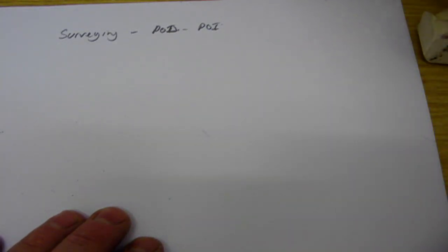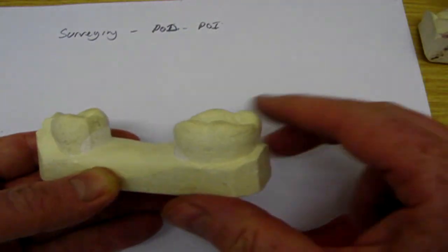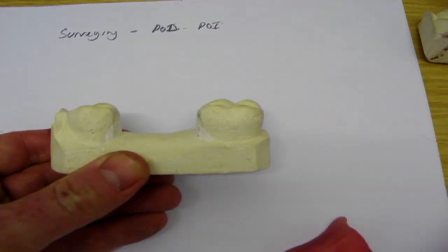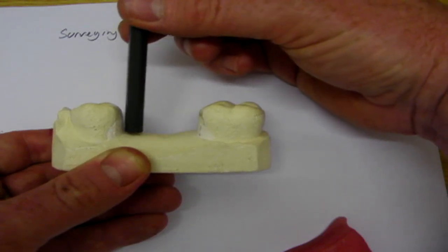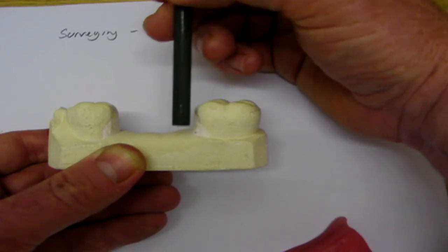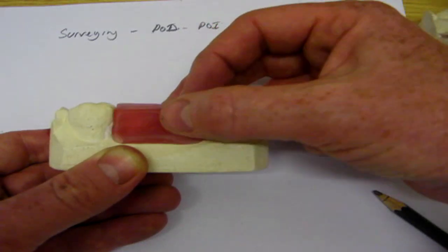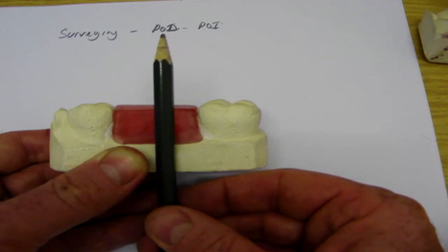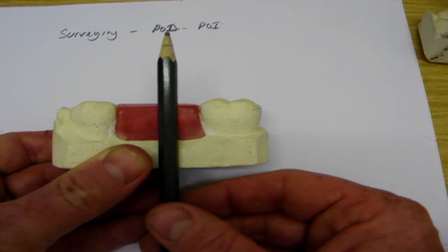The other alternative at the other extreme is to block out the undercut, as you can see I've done on this model, been blocked out with plaster of Paris in this case. So this has been surveyed on the surveyor relative to the path of displacement, and all the undercut relative to that path of displacement has been blocked out. And now we can make our denture so that it drops in and out with no problem whatsoever, and we've made the path of insertion equal to the path of displacement, and an awful lot of dentures are made in that way.